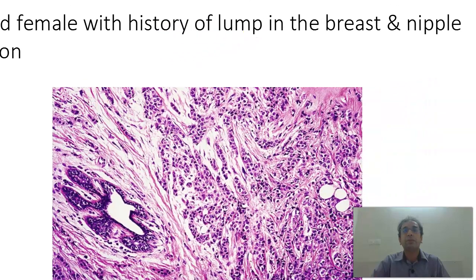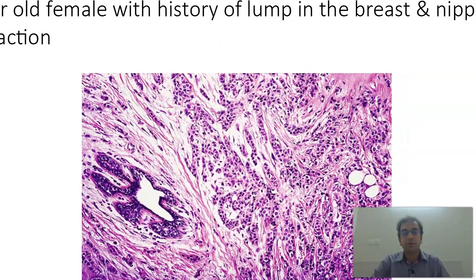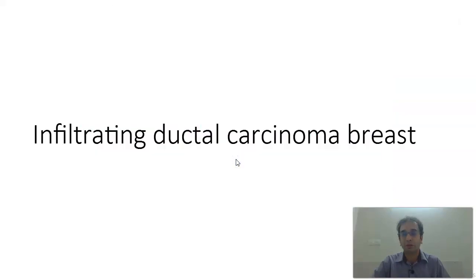A 55-year-old female with a history of lump in the breast and nipple retraction. What you are finding here are the ducts, and you find infiltrating nests of tumor cells — there is infiltration everywhere. Some tubule formation is present and the nuclei look very hyperchromatic. So this is going to be an infiltrating duct carcinoma of the breast.